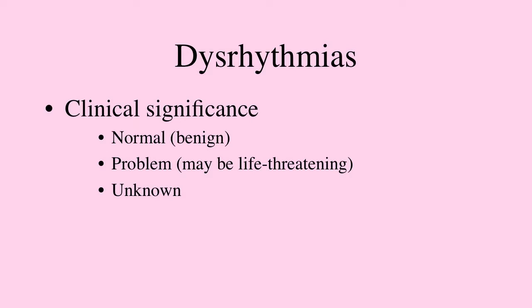If you look at the next slide, same situation. The heart rate here is about, let's see, 300, 150, 100, 75, roughly around 75, so it's easily within the 60 to 100 range. And there's a P wave with every QRS complex, and everything is beating along normally with normal sinus rhythm.